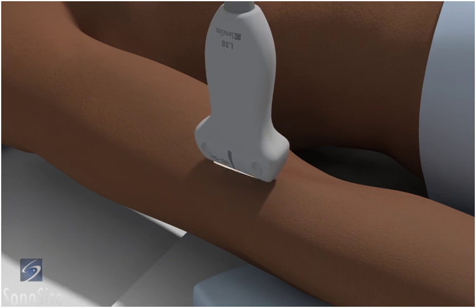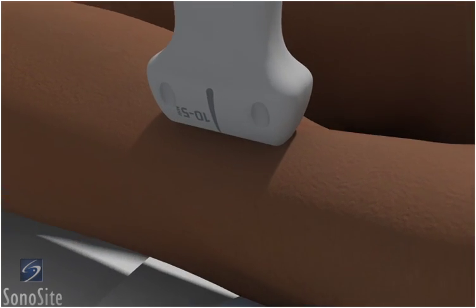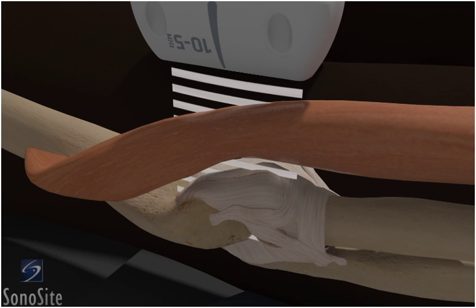The transducer is placed over the distal humerus in a transverse fashion with the orientation marker directed toward the patient's right side.